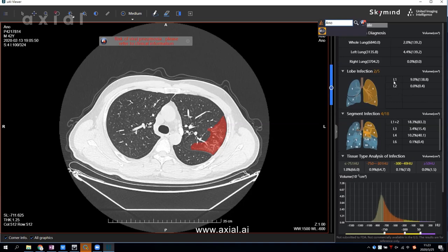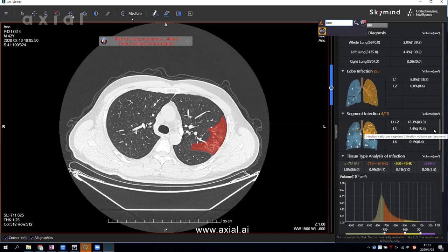The upper and lower lobe of the left lung. Axial AI can go further down to lung segment level. Based on our knowledge, Axial AI is the only software that can provide the most precise measurement at the lung segment level. As you can see here, Axial AI can measure the volume of each infected segment.